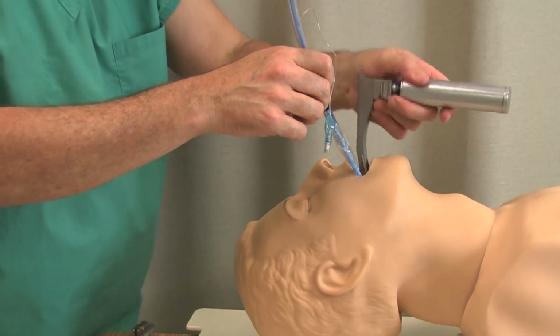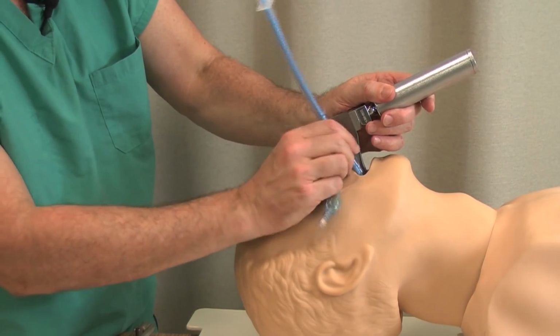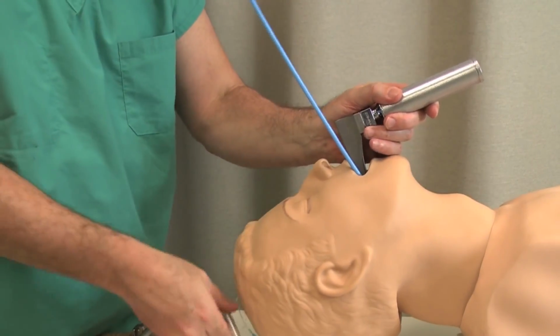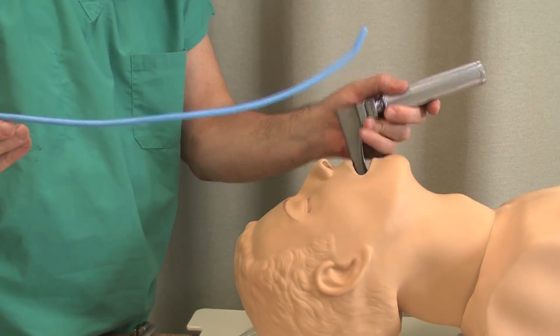Now, I like to keep the laryngoscope in to make sure I can follow this all the way in. Make sure this thing goes all the way in there, so that way you don't bounce it out. But the bougie is a great device and should always be around whenever you're planning on direct laryngoscopy.